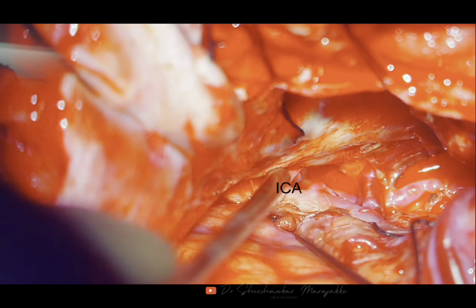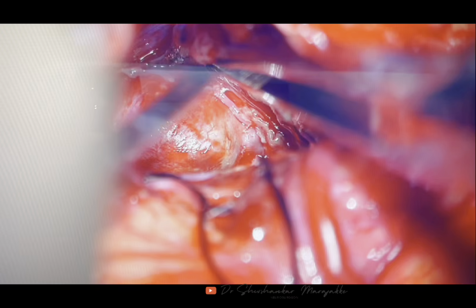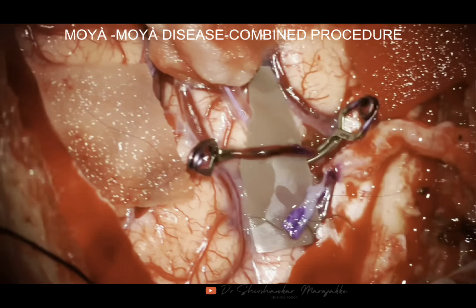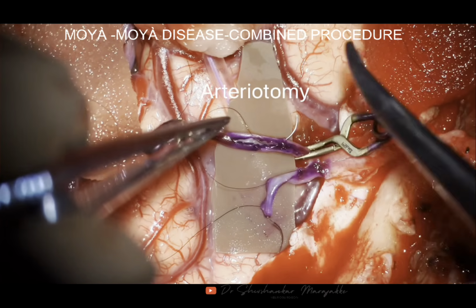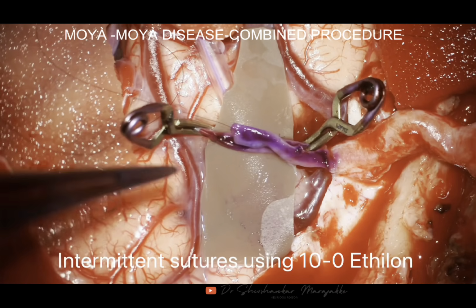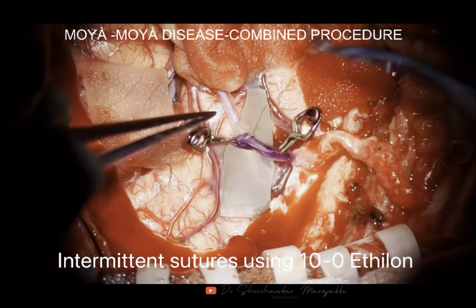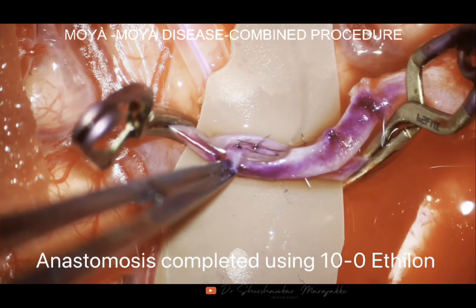Vascular neurosurgery is tough, demands top-notch skills and training, and even with endovascular treatment, it still teaches you the gutsy skill to handle the cerebral vessels in brain surgery and tackle vascular complications head-on. In this AI and robotic era, mastering microsurgical skills like microvascular anastomosis gives us that extra edge. It's the same suture technique we all know, but taken to the highest zoom level with the smallest vessels around 0.6 to 1 millimeter, very small instruments, and suture materials like the ones we used in this case. It is just a shift in mind and materials to the micro zoom level, because we all do suturing as surgeons.